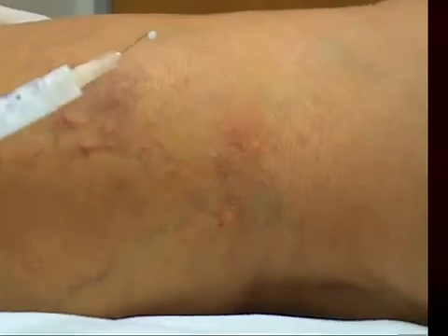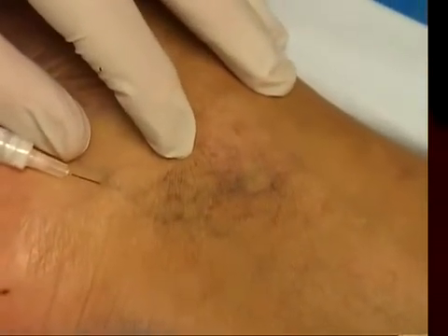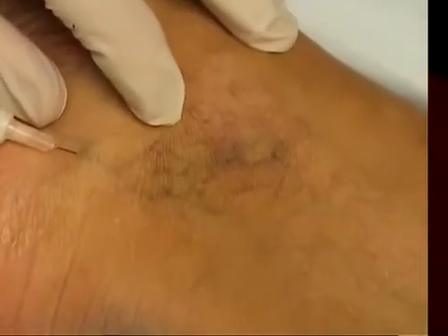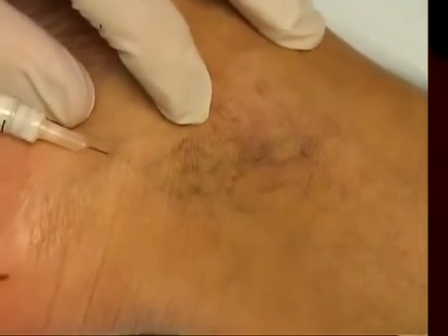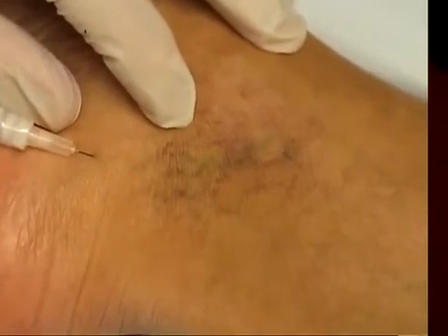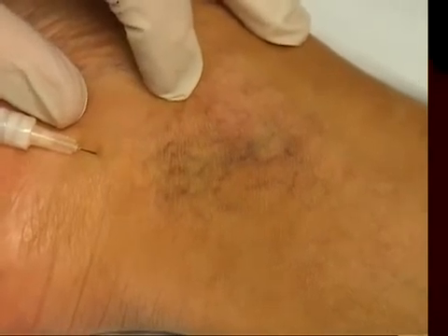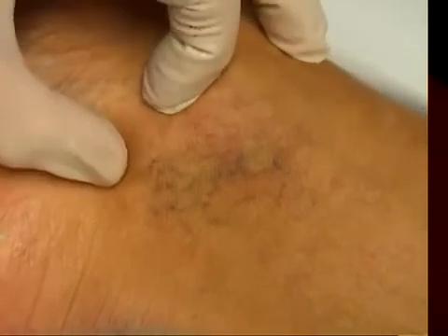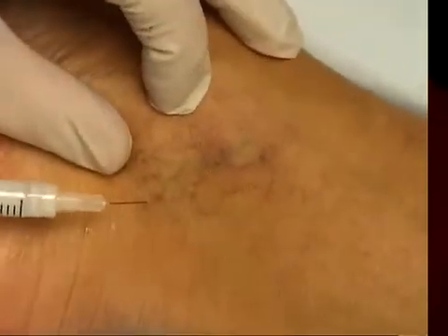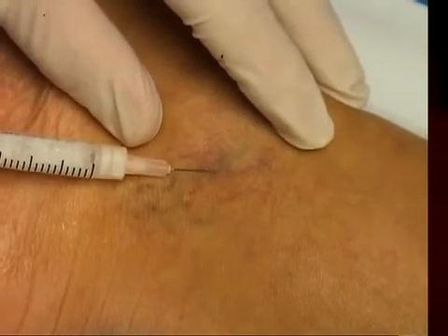I think that's looking very nice. Just a little needle — keep very still. I'm going to be fine. I'm not going anywhere, I promise. You okay? I'm fine. I think my next time I come in I'll be better — you just know what to expect.